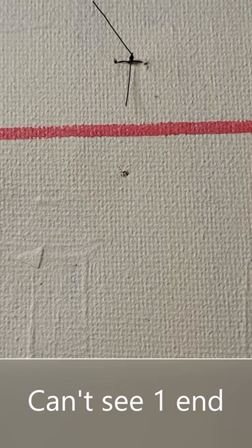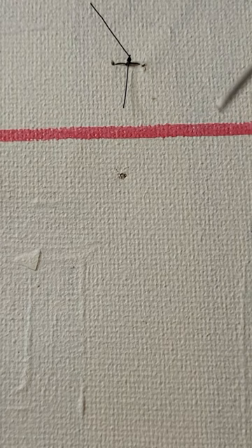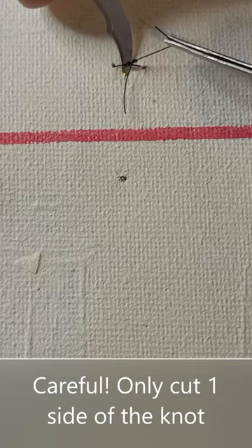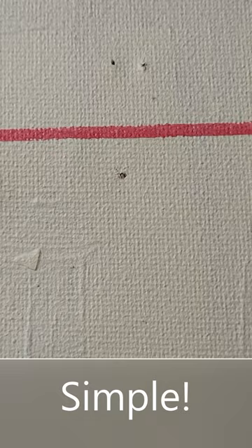Sometimes with the horizontal mattress suture the skin can be a bit buckled and one end can be buried in the skin so you can't see it. If you can only see one end, pull that up, put your instrument under that side, and cut it on one side only. Don't cut both sides, otherwise you'll never get the stitch out. Cut one side, then pull the stitch out — simply done.